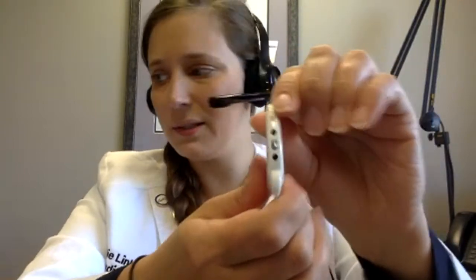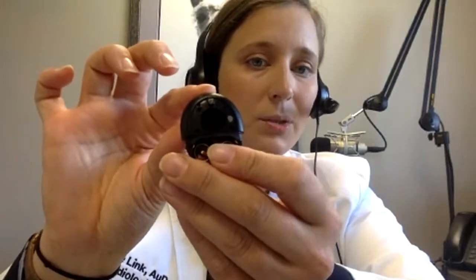So these ones are pretty easy to see. I'm going to do the demonstration on the off-ear implant just because it's a little bit more complicated, but it's going to work the same way as the behind-the-ear implant. So on here, again, if it stops working, go ahead and change those batteries. You guys know how to do that already. But we can also change the mic filters on this little one too. You can see the openings to the mic filters here and here. What we're going to do is take off that cover. That's going to expose the actual mic covers down through here, which is pretty cool.